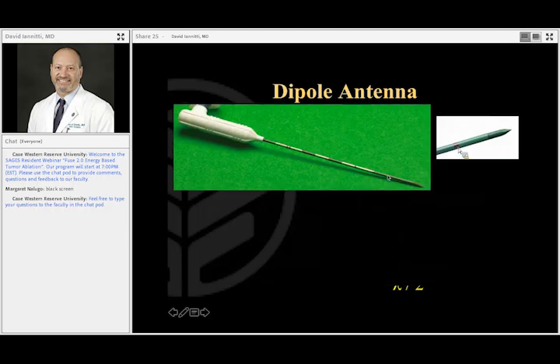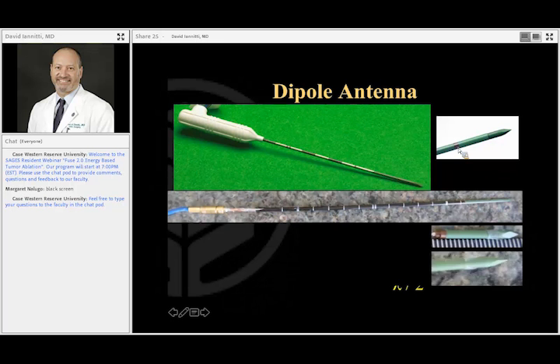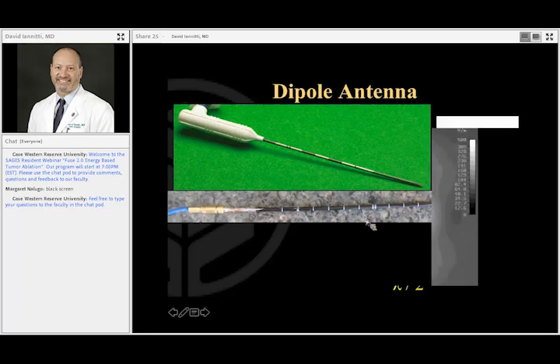And so in the middle of the dipole, you have this. So this is where the conductor rolls back. And so that is the source, and this is the antennas all taken apart, is what we do, is that the feed point of the microwave itself, you can see there's a half a wavelength right here, the feed point is where the inner and the outer conductor are folded back and perpendicular to each other.